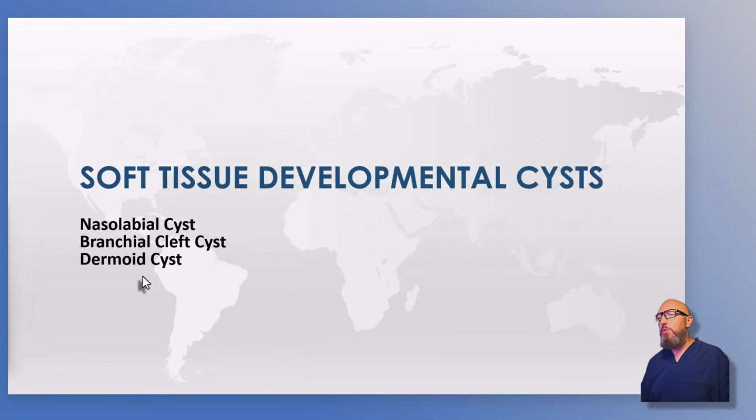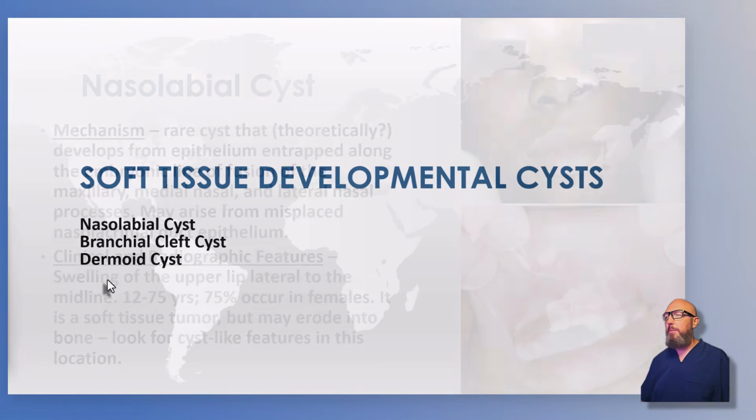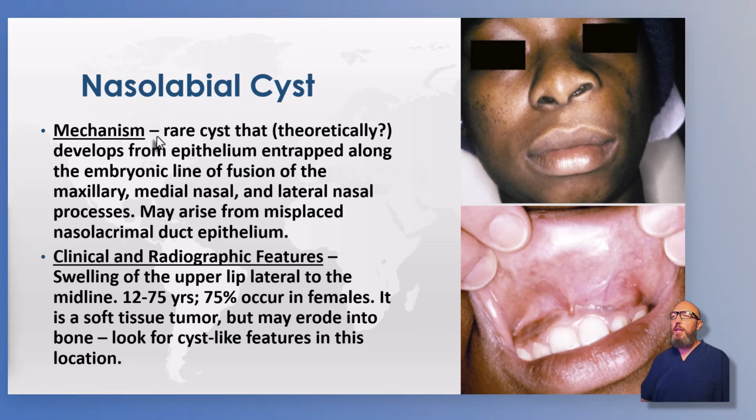All right, now these ones I'll go through quickly. I'm kind of covering these just for sake of being thorough. Not my favorite ones because they don't typically occur on radiographs, but we do need to talk about them a little bit here. So, nasolabial cyst.